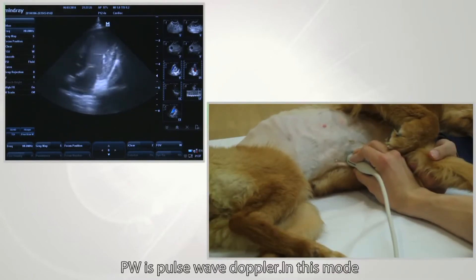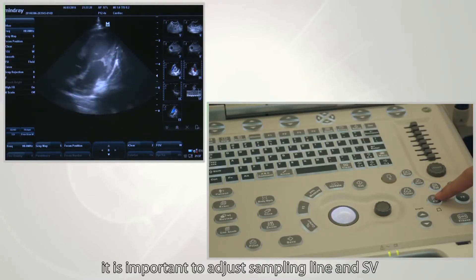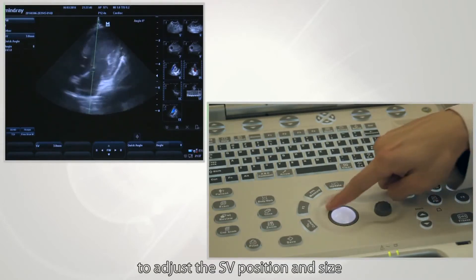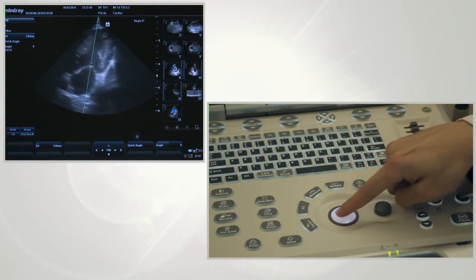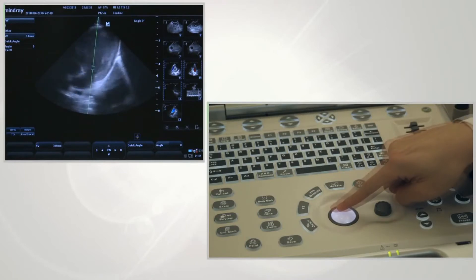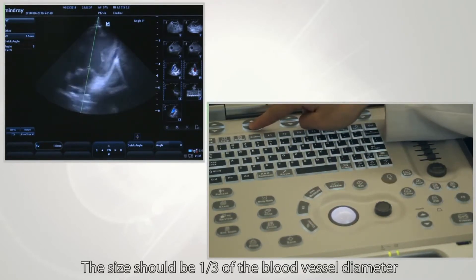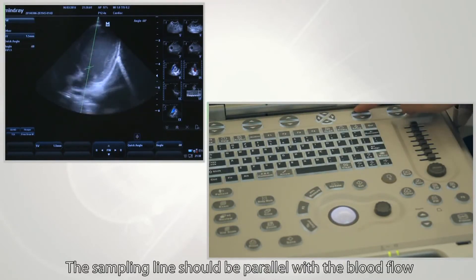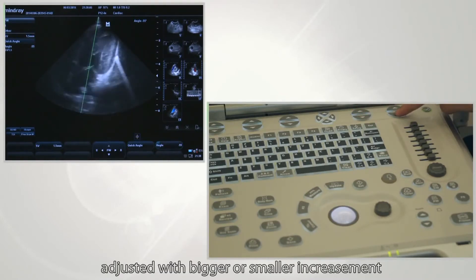PW stands for pulse wave Doppler. In this mode, it is important to adjust the sampling line and SV. Enter PW mode and roll the trackball to adjust the SV position and size. The size should be one-third of the blood vessel diameter. The sampling line should be parallel with the blood flow. The angle of the sampling line can be adjusted with larger or smaller increments.